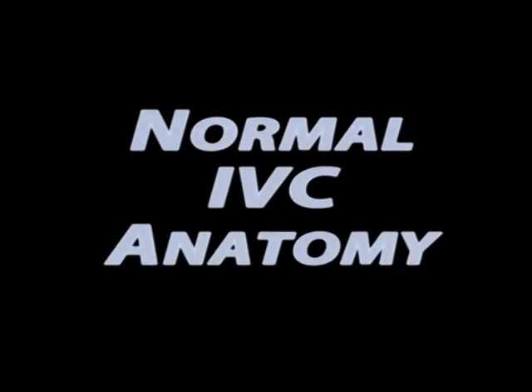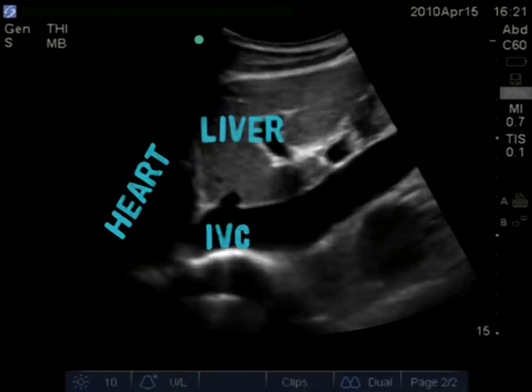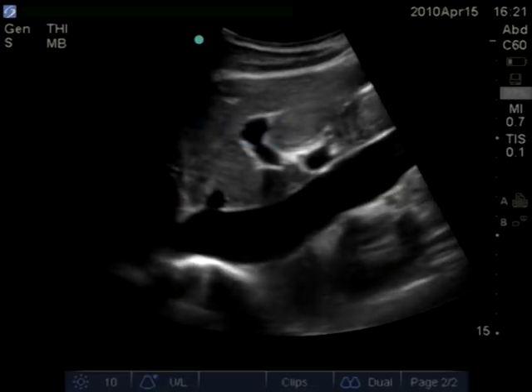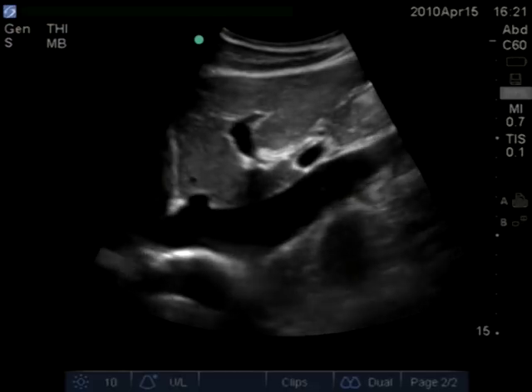Let's go through the normal anatomy you'll see on your ultrasound screen. You see the IVC — the black thin-walled structure underneath the liver — and you're getting just a cut of the heart, the right atrium. That's the proper position when you have just a little bit of the heart there.